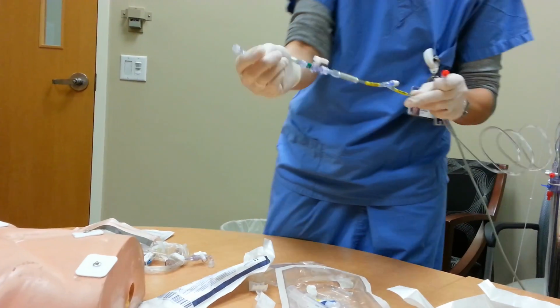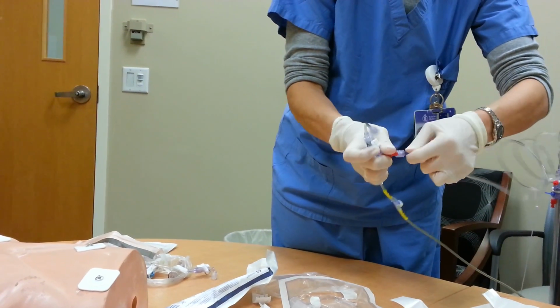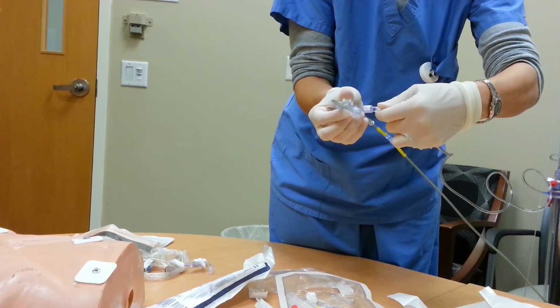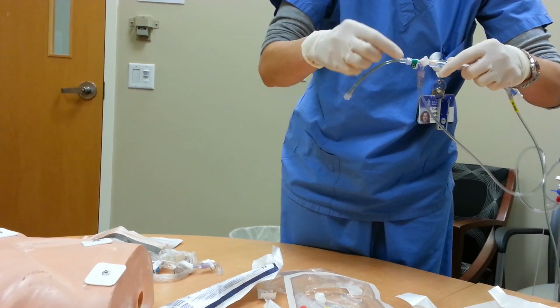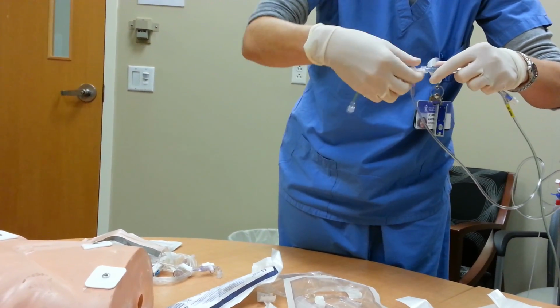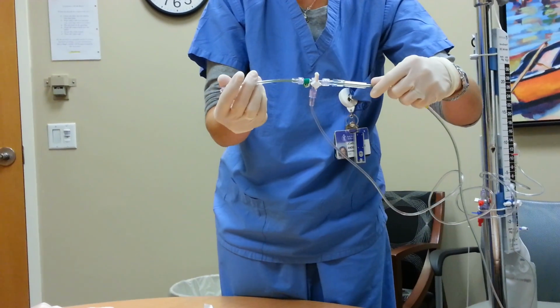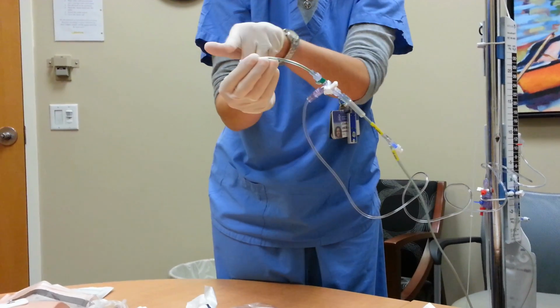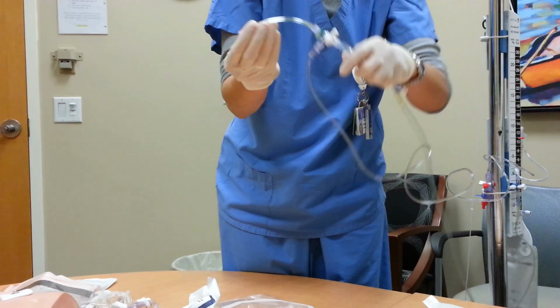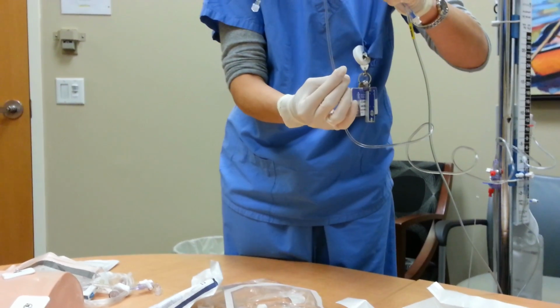So this is, of course, the drainage part that's attached to the catheter. You take your transducer tubing and you connect it to the stopcock right there. The position of this stopcock is important. Typically what you're going to have is, if you are draining, you're going to have it open 3 ways. This will facilitate drainage. This is our patient over here, so the CSF will drain this way. And this is the transducer. So you are draining and transducing a pressure at the same time.